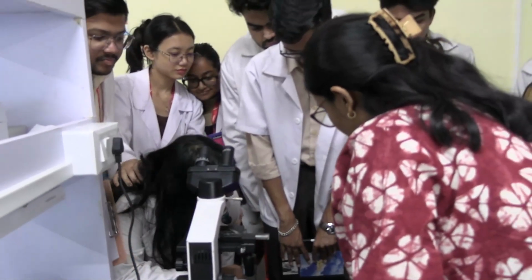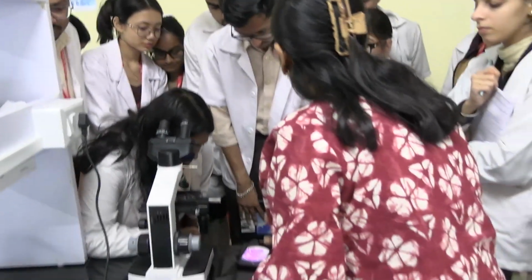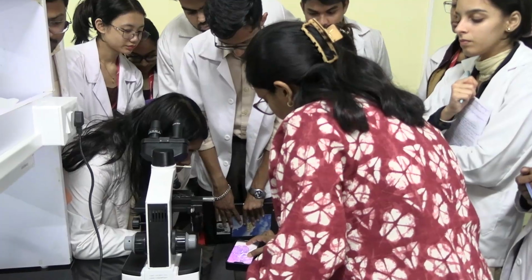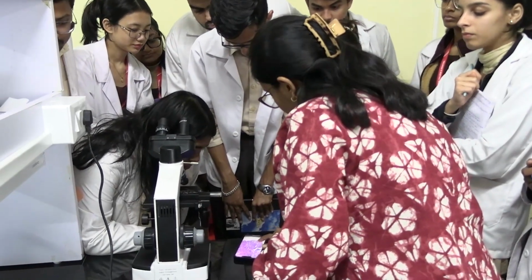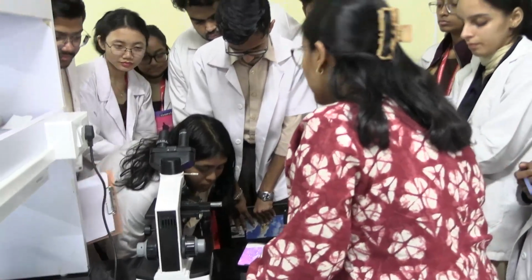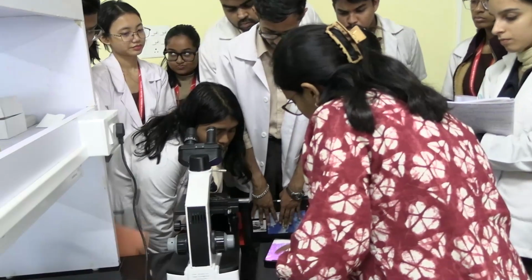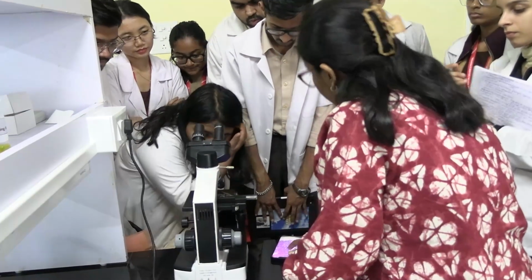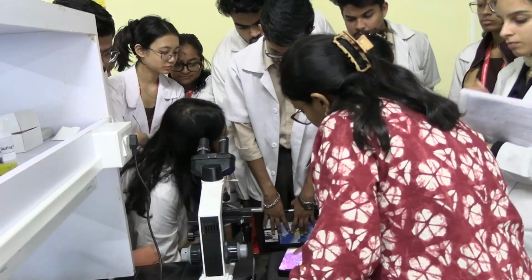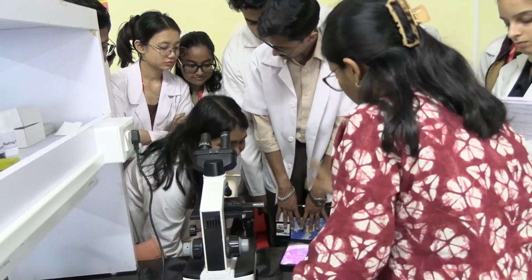See that in comparison to this area, does it appear more blue? In comparison to these two glands, are these glands appearing more blue? That is because of nuclear hyperchromasia. So, when I go on high power, what do I see? There is nuclear pleomorphism. See, the cells, they are not showing similarity to one another. Yes? And then these glands are seen invading into the submucosa. Remember the terms, okay? Submucosa, and they're also showing more bluish nucleus, right?